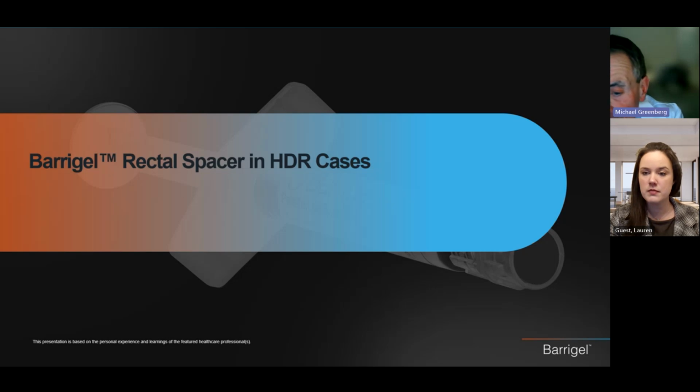So what about brachytherapy? I love doing brachytherapy. We do 1 to 2 cases a week, and I'll tell you, I am absolutely sold on using it with Barrigel. So there's 2 ways, obviously, whether you do these are high-risk patients. So the question would be is, do you do the boost first or do you do the boost after? And both are great. I do the boost after. I put the Barrigel in initially before the external beam, but either way is absolutely fine.